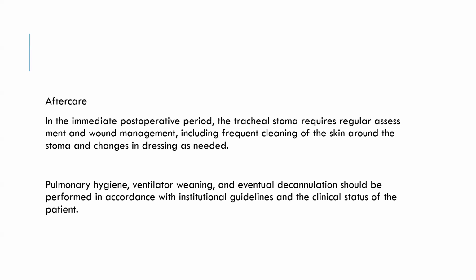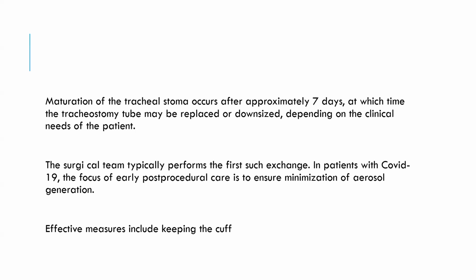Then aftercare. In immediate postoperative care, the tracheal stoma requires regular assessment and wound management, including frequent cleaning of the skin around the stoma and change in dressing as needed. Pulmonary hygiene, ventilator weaning, and eventual decannulation should be performed in accordance with institutional guidelines and the clinical status of the patient. Maturation of the tracheostoma occurs after approximately 7 days, at which time the tracheostomy tube may be replaced or downsized, depending on the clinical need of the patient. The surgical team typically performs the first such exchange.